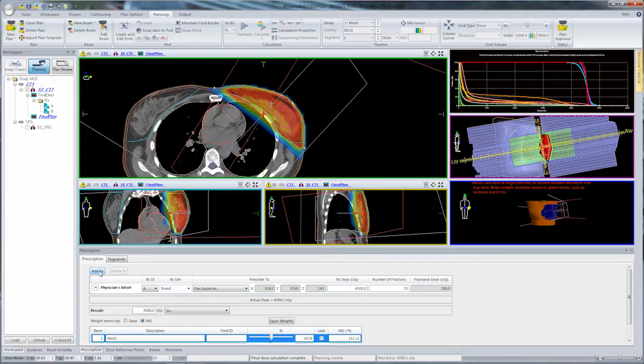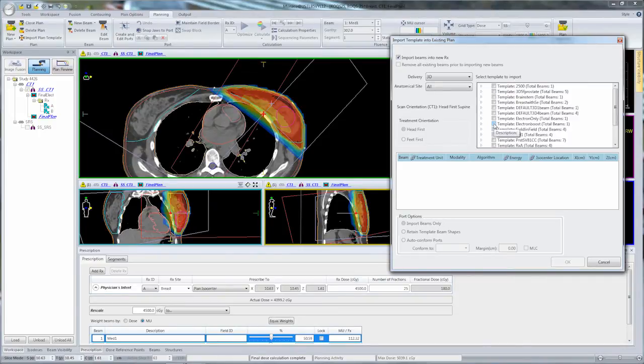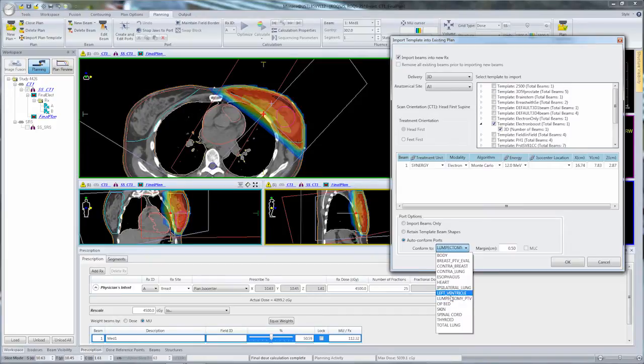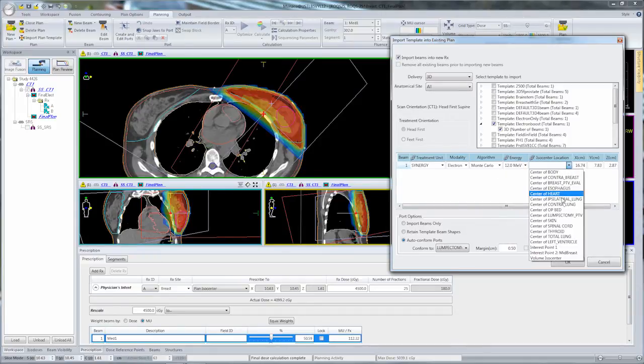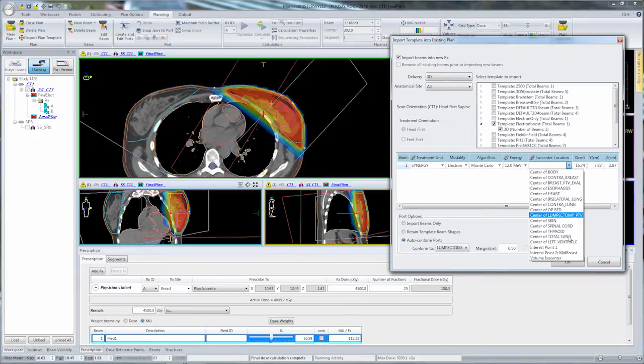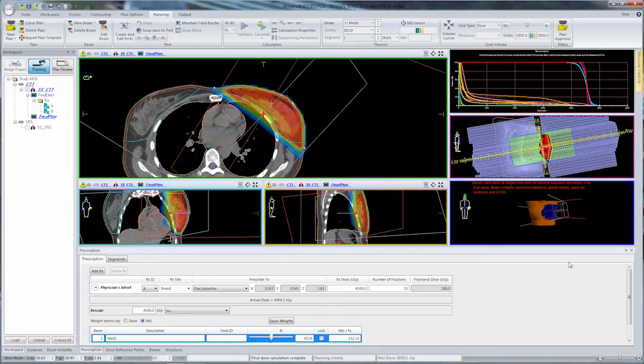I'll click on the Add Rx button on the prescription dialog. Then I'm going to choose an electron boost template and auto-conform that to the target, which in this case is a lumpectomy PTV with a half centimeter margin using a 12 MeV electron beam. I'll set the ISO center to the center of that lumpectomy PTV. This template will include the electron applicator snapping the field to the target.